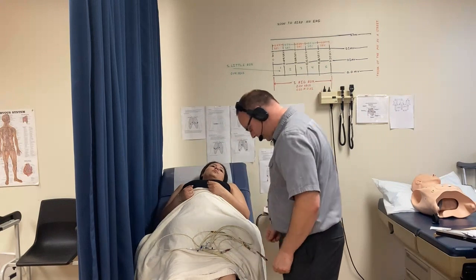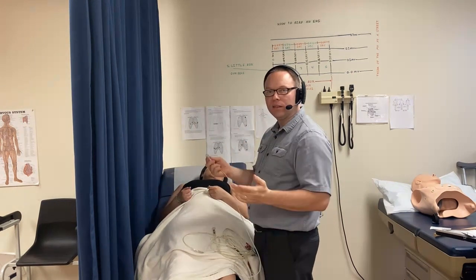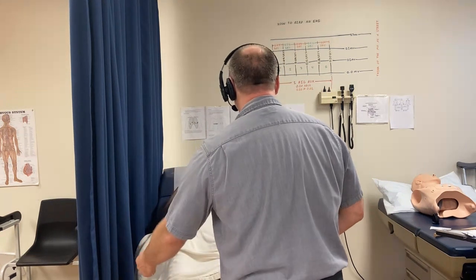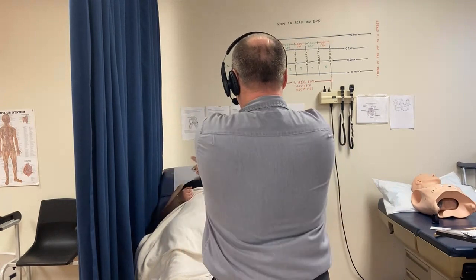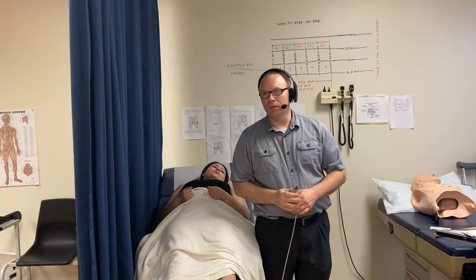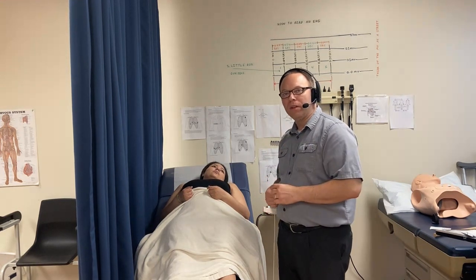Now let's look at the lead labels. 'LL' stands for left leg. The number one mistake students make is confusing their left with the patient's left. If you're looking at your patient face-to-face, your left is their right. But if your eyes are looking the same direction as the patient, your right is their right. The number one reason I see messed-up EKGs is students getting right and left mixed up.